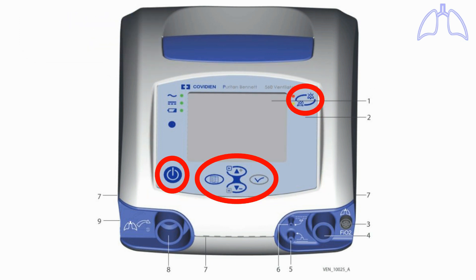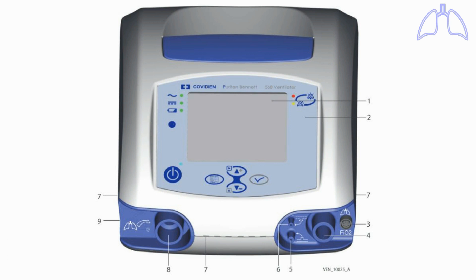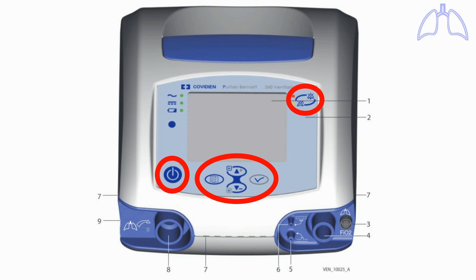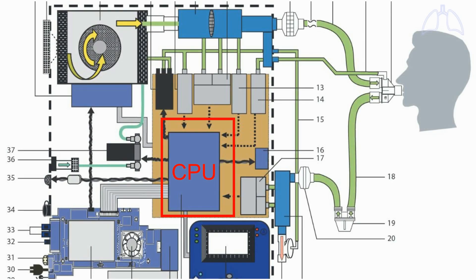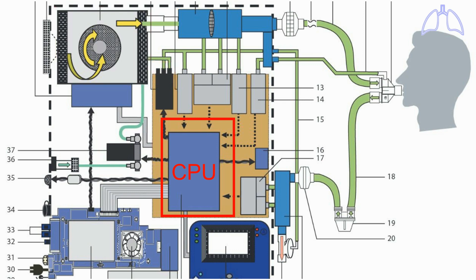The user can send data to the CPU via these buttons. The CPU processes the received data according to the instructions of the software program, then it sends output electric signals to the actuators.